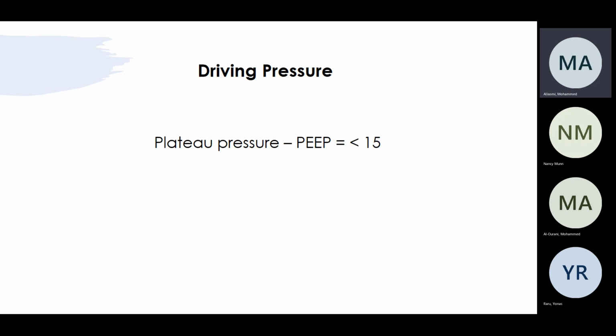Did you change the driving pressure? You did not change the driving pressure, is that right? But if I go 2 and it goes only by 1, and then after 5-10 minutes the plateau pressure goes back down and stabilizes on 28, I recruited more, is that right? Because I gave PEEP, the plateau pressure did not rise and maybe even went down. So I'm recruiting more. The other thing which is very important, but we'll talk about it in a different lecture, is the stress index. Okay.